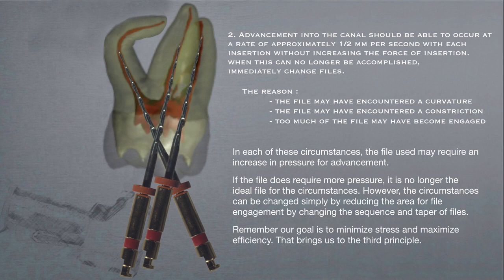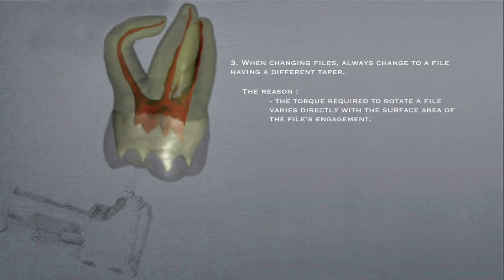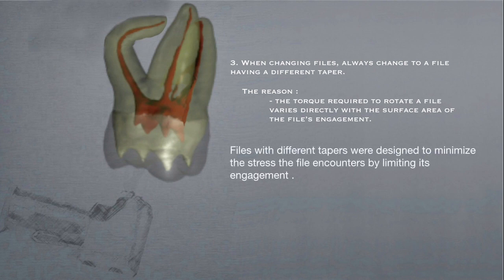And that brings us to the third principle. When changing files, always change to a file having a different taper. The reason? The torque required to rotate a file varies directly with the surface area of the file's engagement. Files with different tapers were designed to minimize the stress the file encounters by limiting its engagement.